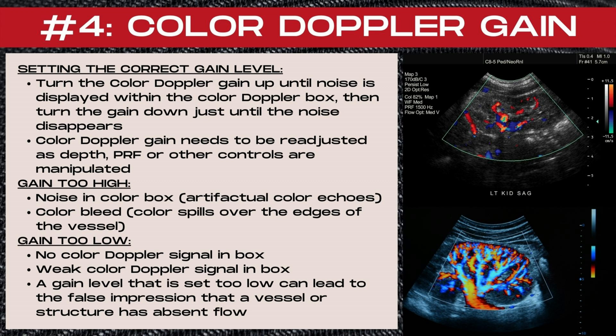The next step in our color Doppler optimization checklist is to optimize the color Doppler gain. Grayscale is not the only thing that has its own gain level — the color Doppler, spectral Doppler, and power Doppler controls also have their own gain controls. The color Doppler gain control amplifies the Doppler signals in the ultrasound machine. To set the correct color Doppler gain level, turn the gain up until noise is displayed within the color Doppler box — those little extra speckles of color — then turn the gain knob down just until the noise disappears. This is the optimal color Doppler gain level.